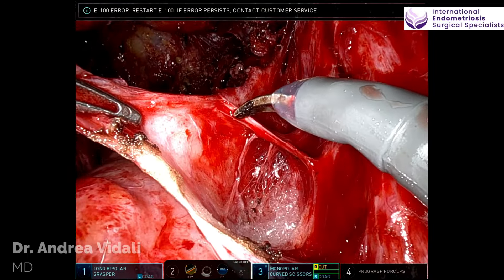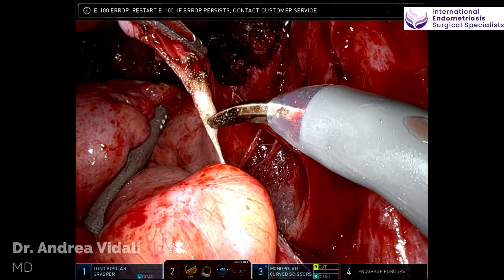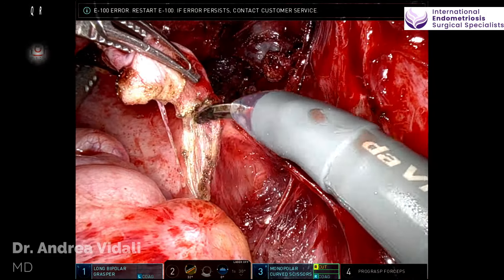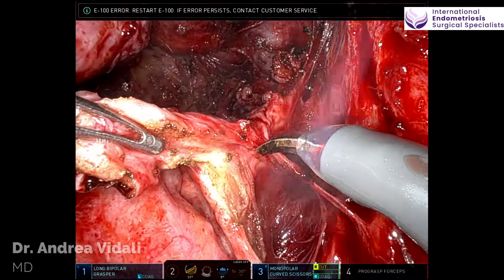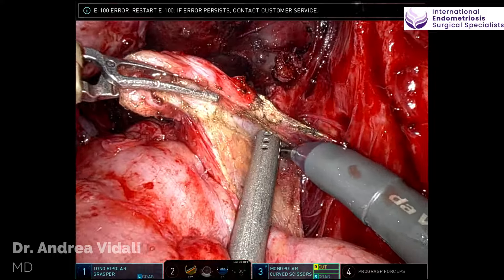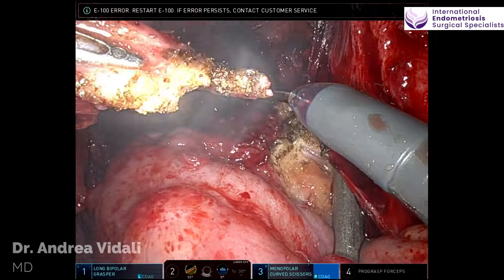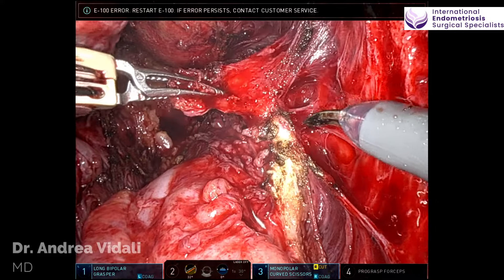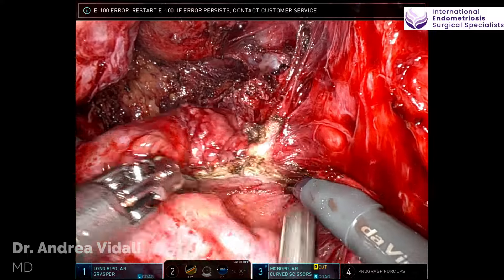In this case, the disease was deep, but not so deep that it required going completely into the posterior rectal space, so we could just stay anteriorly and work in the mesorectal area. Great attention is paid to preserve the nerves. Many nerves can be invaded, but we do know that any endometriotic lesion within three centimeters of a nerve can affect the nerve's behavior.